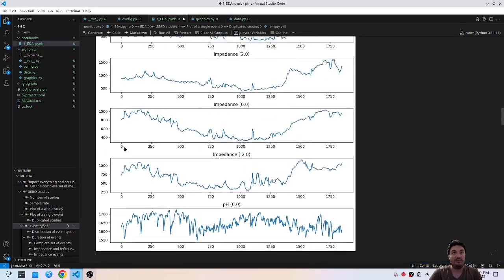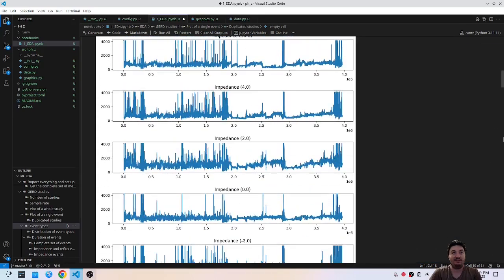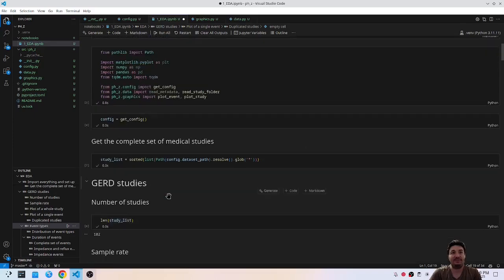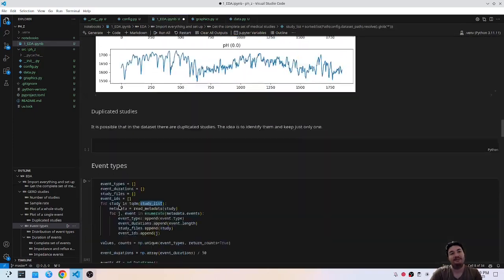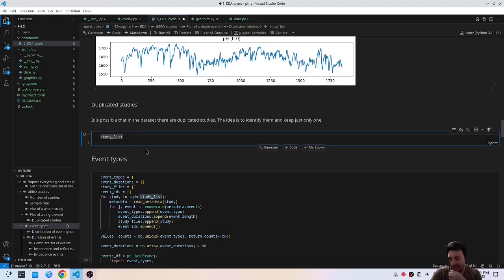So how can we do this? Maybe can we compare, for example, this pairwise here with the hash in the NumPy array or in the JSON?